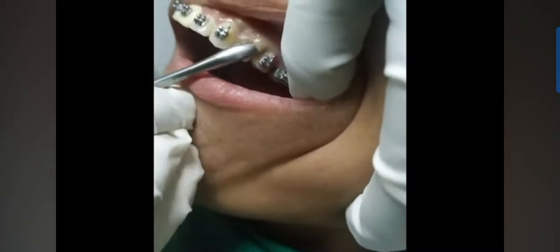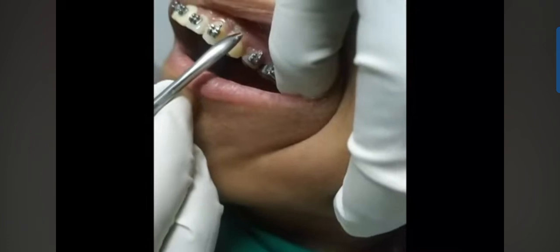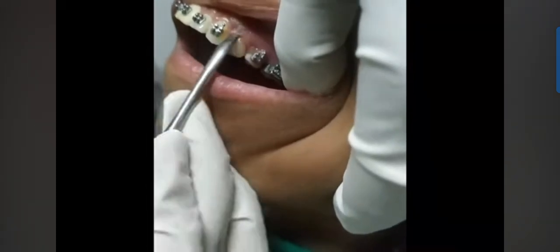What common mistake most new learners make is that they directly put the periosteal in the labial region instead of moving from mesial to distal. In this way the gingiva might get torn. So always move your periosteal from mesial to labial and labial to distal. In this way, we are also loosening the PDL and we are exposing the root region.